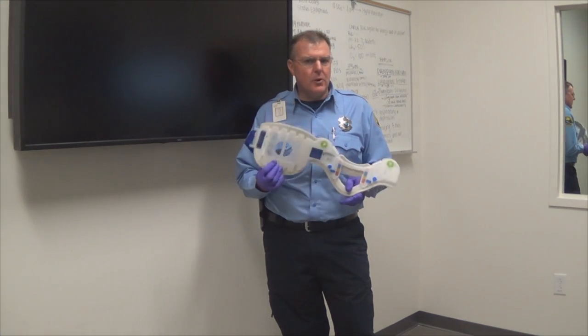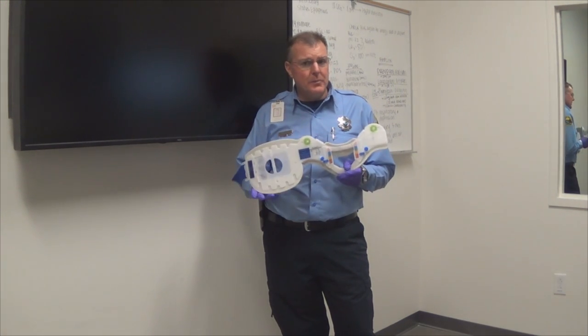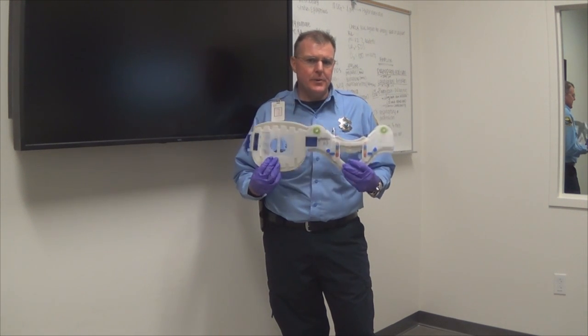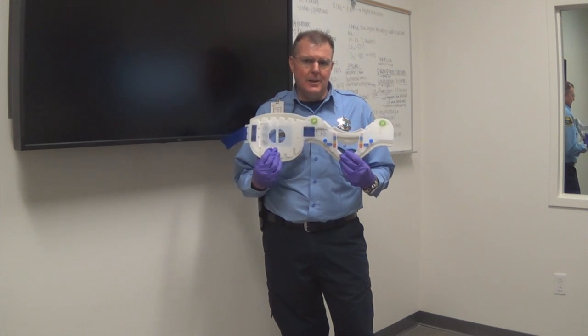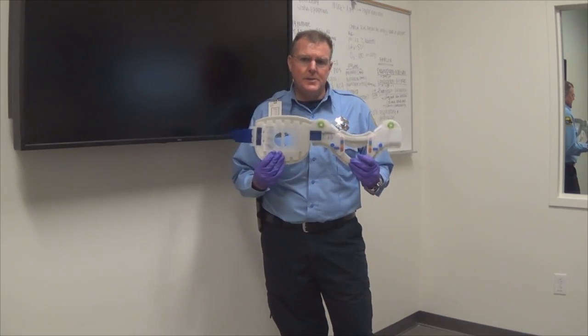There's been a lot of articles in the news about the use of C-collars and maybe going away from those C-collars and using some other type of device, because these can cause an injury to your patient. So you must properly size these. We're going to go over exactly how to properly size and place it on your patient.